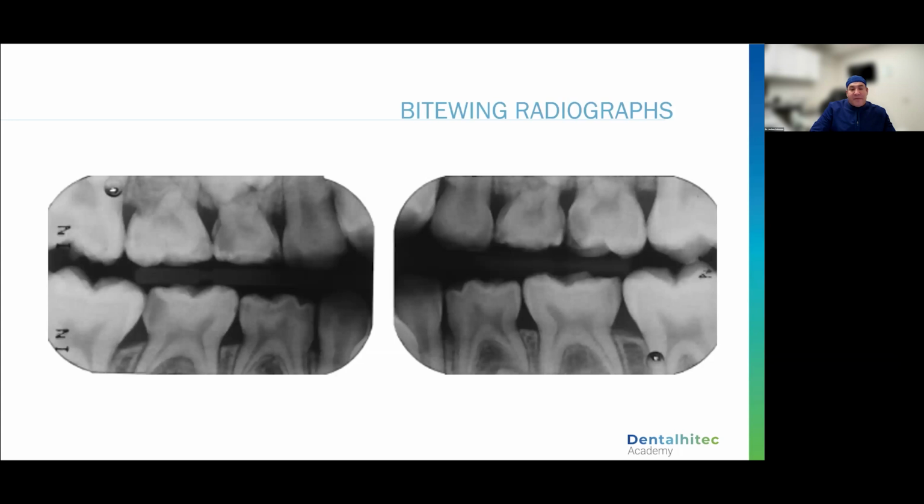We're going to check our bitewings every single time for caries and also for placement of our local anesthetic. Now here, there's no infection. You've got good organized bone. You're just going to make your choice of your injection site based on how many teeth you need to numb. Again, on that lower, 1 tooth distal, 2 teeth mesial. On the upper, it may be 2 and 2. And if you're treating many teeth in that quadrant, canine all the way to permanent first molar, you may find that you need to give 2 intraosseous injections. You may not get profound anesthesia going all the way to that canine if you also need profound anesthesia on your adult first molar there.